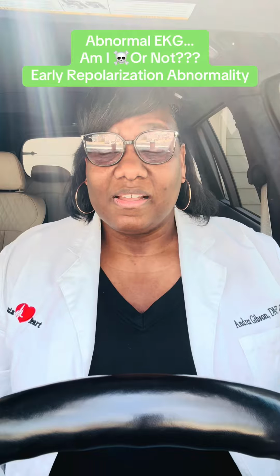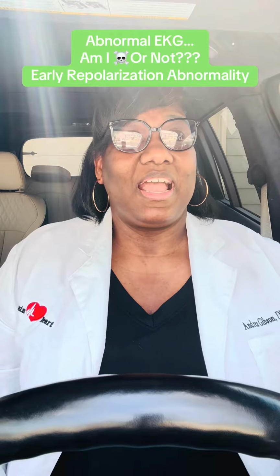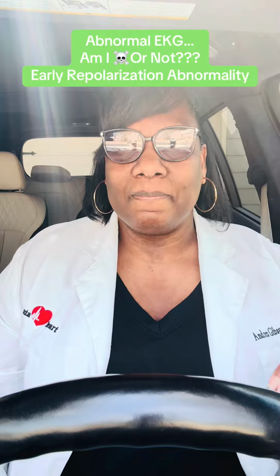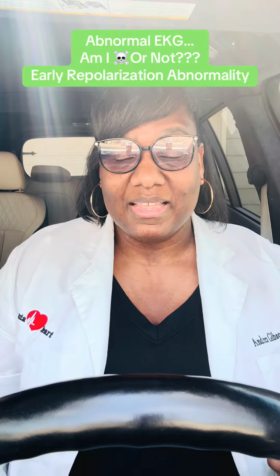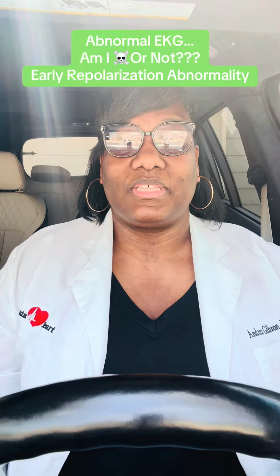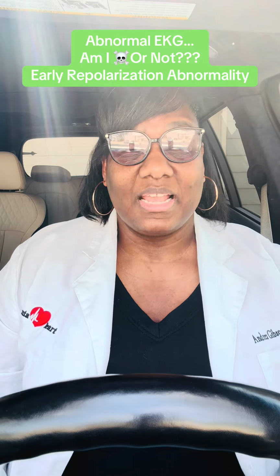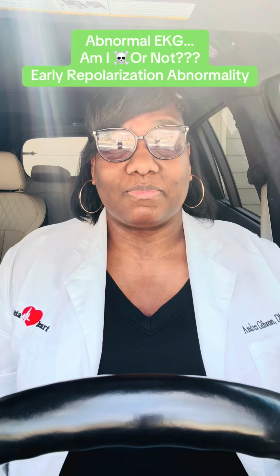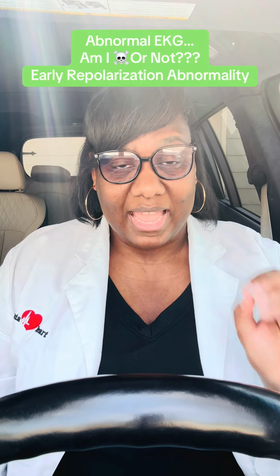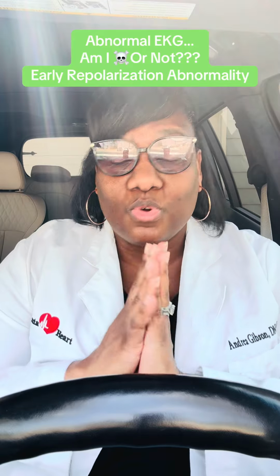Today's teaching lesson is about early repolarization because without question, this is the most misinterpreted finding for a STEMI that cardiology comes across, and it's not your fault. Thank you for consulting cardiology for this, but I'm going to give you some insights and bullet points so you can discern and differentiate ST segment elevation STEMI versus early repolarization.